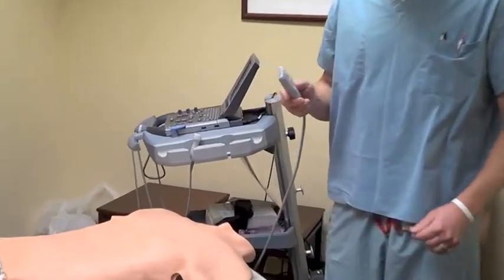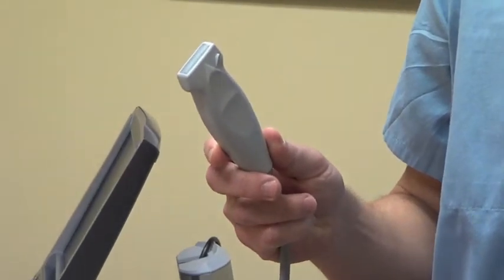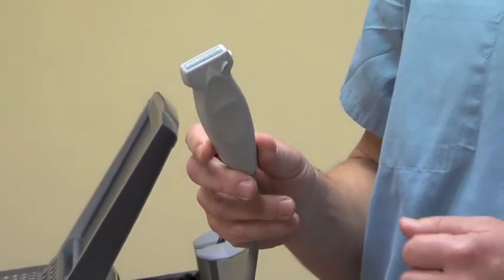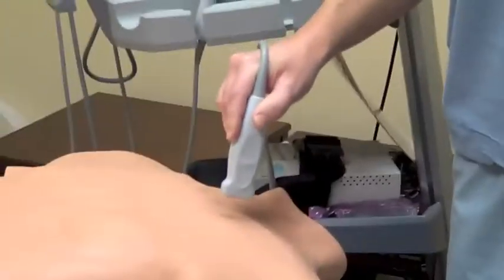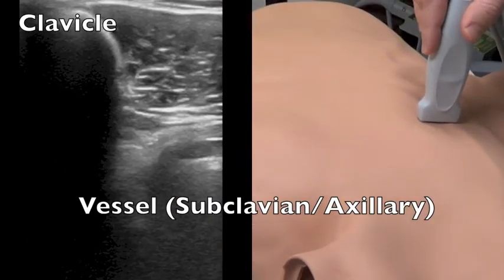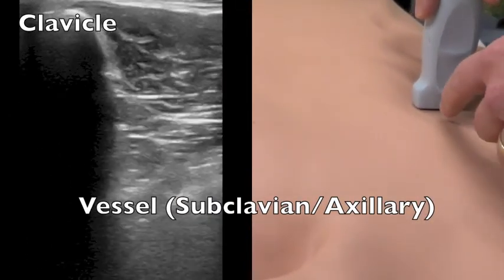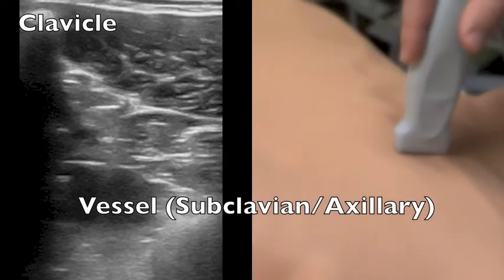First thing is to identify the probe that we use. We use the vascular probe just as we would with the internal jugular vein. The ACC guidelines recommend placing the probe on the clavicle itself, then identifying the vessel as it comes out from underneath the clavicle and identifying the clavicle by means of the shadowing of the bone.